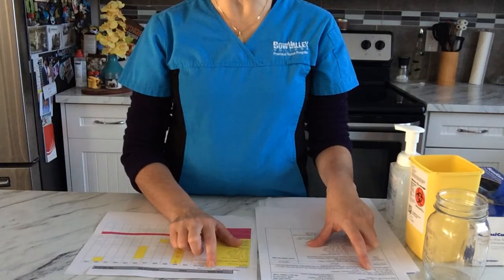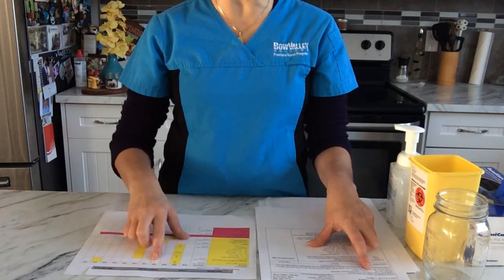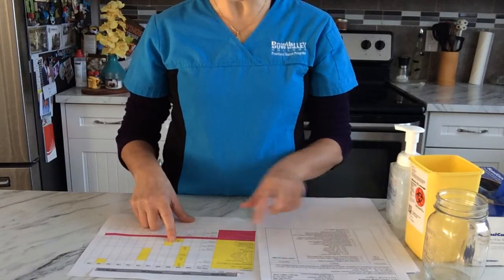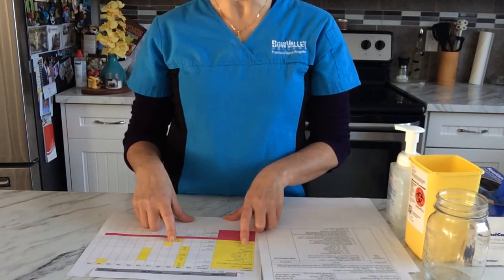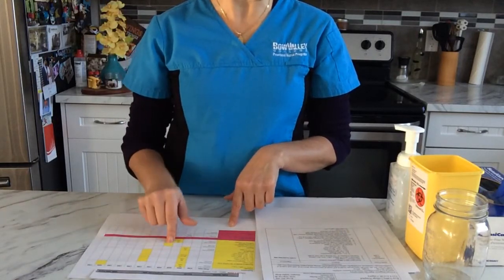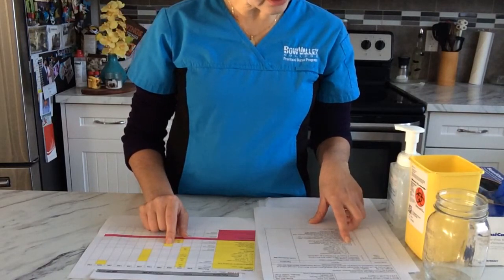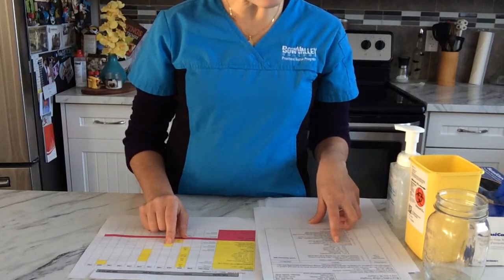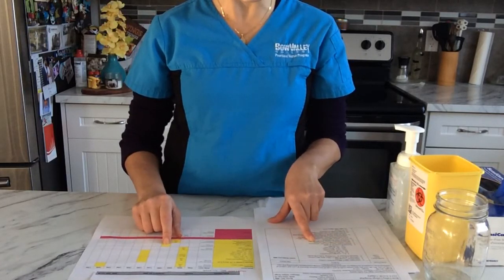We have today's date, December 1st, 2020. It is 10 o'clock and we have to administer heparin 5000 units subcutaneous BID until full ambulatory. It hasn't been given yet, so that's the one that I'm going to administer today. The doctor's order says heparin 5000 units subcutaneous BID until ambulatory.